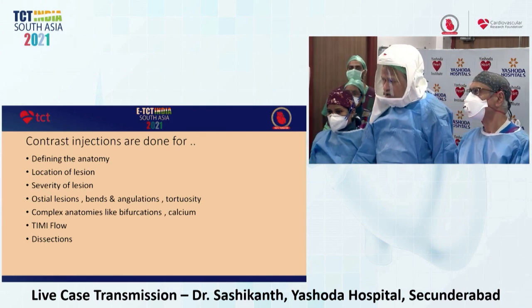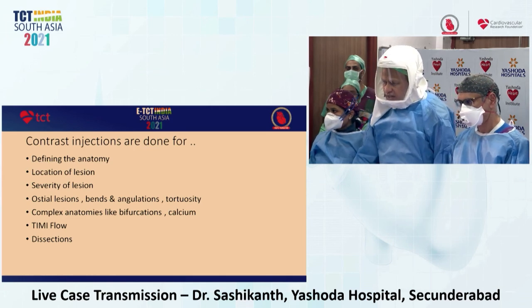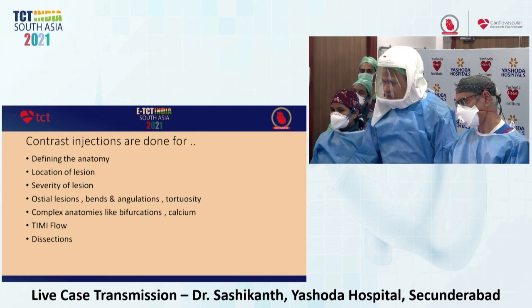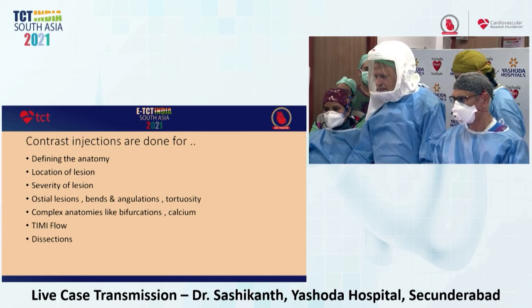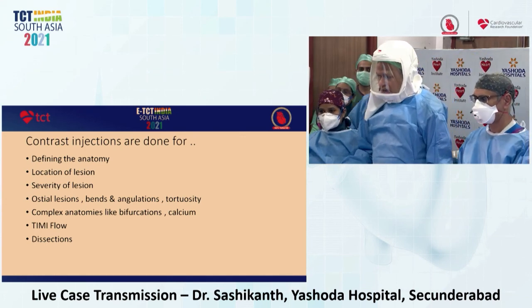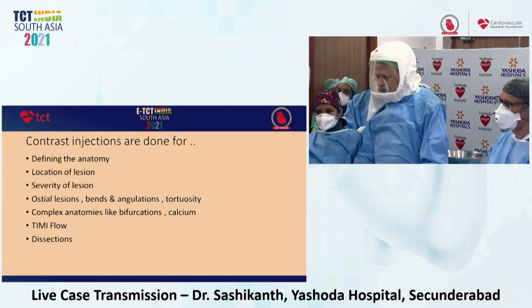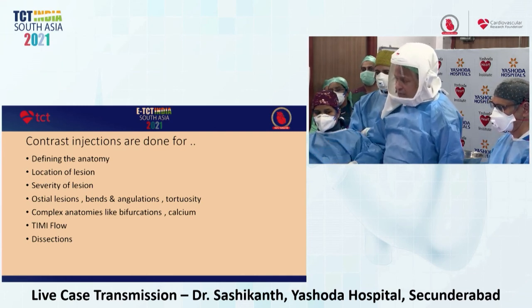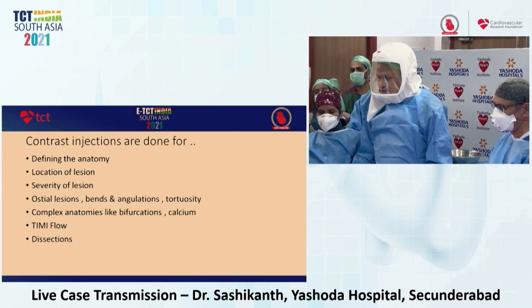So we have a lot of advanced coronary artery disease patients coming in with a high incidence of comorbidities, especially with CKD, and this patient had an acute kidney injury post-contrast. The cardiovascular management is becoming quite challenging for this group of patients, and we have a significant innovation in technology which has changed the way we plan, changed the way we perform the PCI. Then we know that there's a strong correlation between the contrast volume and the risk for acute kidney injury. So every increment of about 75 ml of contrast use increases the risk of acute kidney injury by about 42% as per the NCDR CathPCI registry.